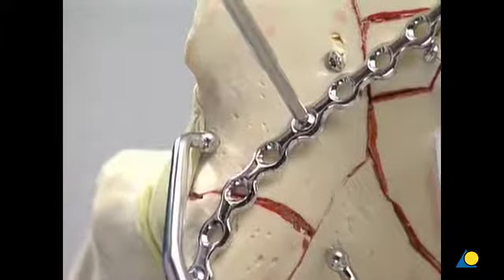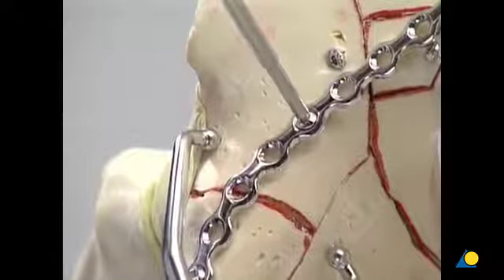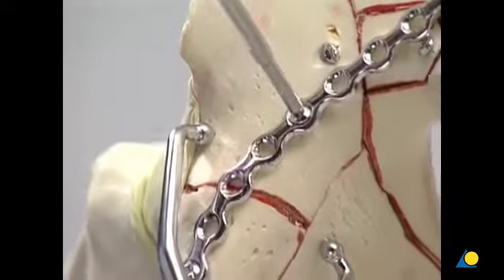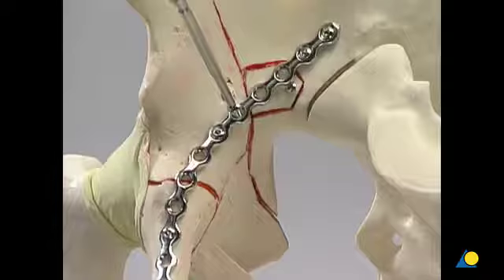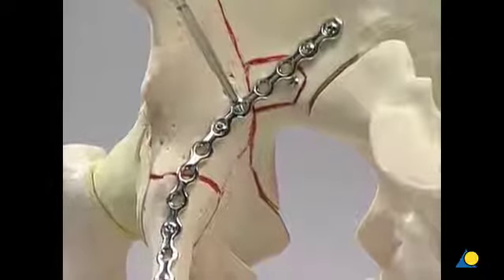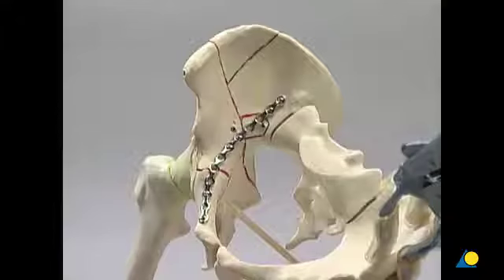Now the posterior column is fixed by inserting a lag screw through the plate. This screw is directed towards the ischial tuberosity. The reduction forceps is removed. A lag screw is inserted through the adjacent proximal plate hole, oriented in the direction of the ischial spine. It is not necessary to fill all the plate holes with screws. Screws must not be inserted through the plate holes in the area of the iliopectineal eminence, so as to avoid the serious risk of penetrating the hip joint.